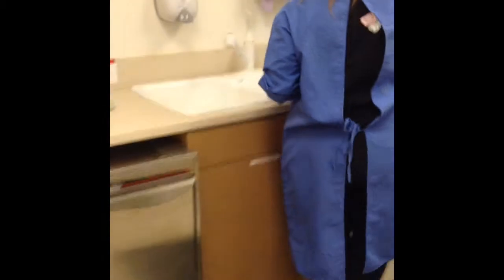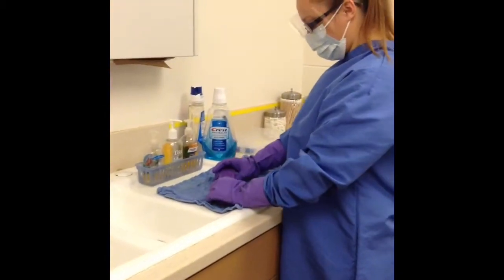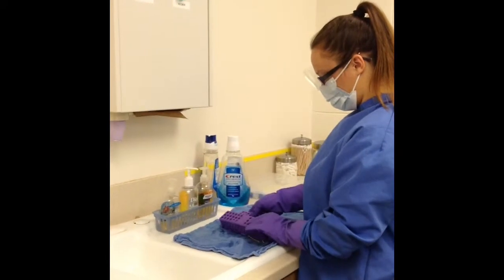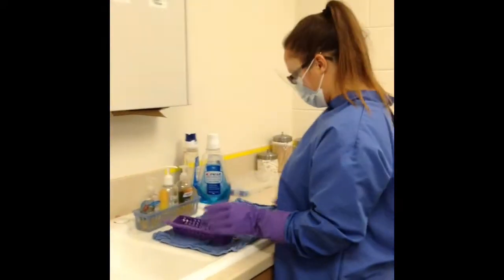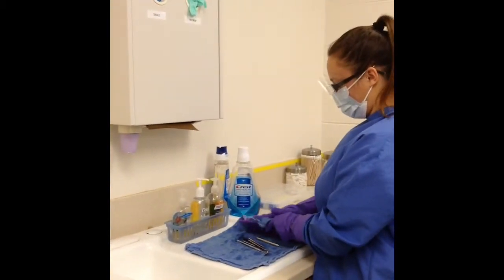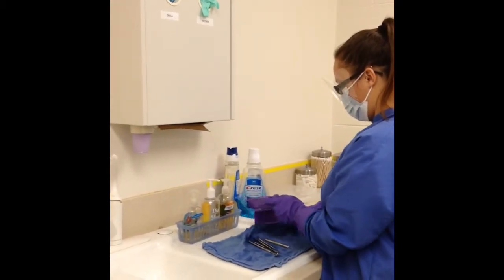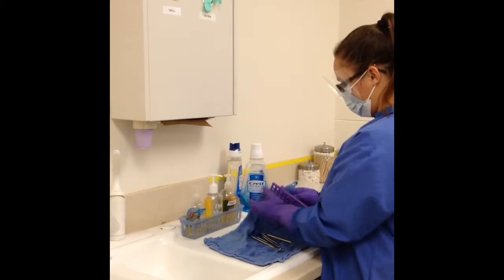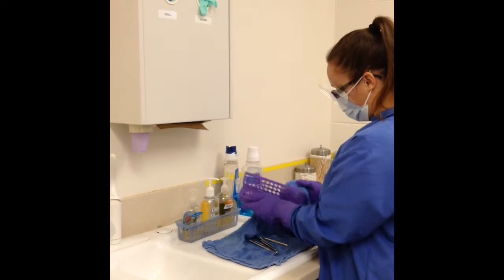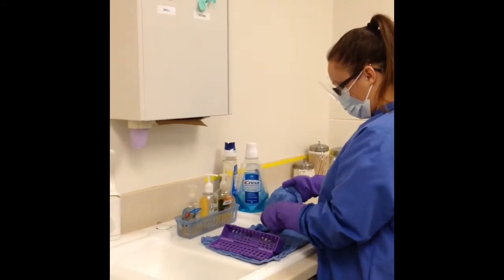We are now ready for the packaging and wrapping portion of the sterilization steps. The purpose of packing the instruments before processing through a sterilizer is to prevent them from becoming contaminated once they are sterilized during storage or when being distributed to chairside. The purpose of drying everything completely is so that rust does not form on the instruments.